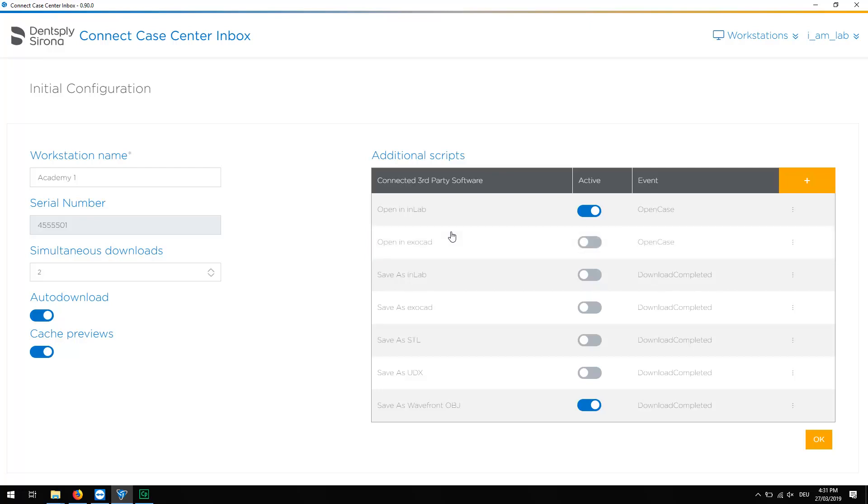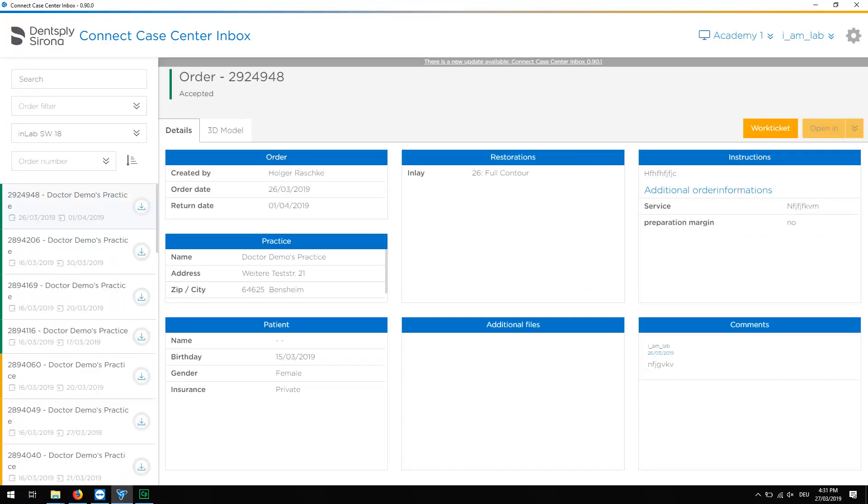After we have completed our initial configuration, we switch to the Inbox Start page by tapping OK. In case you would like to display the configuration page again, click the small icon in the upper right of the screen.